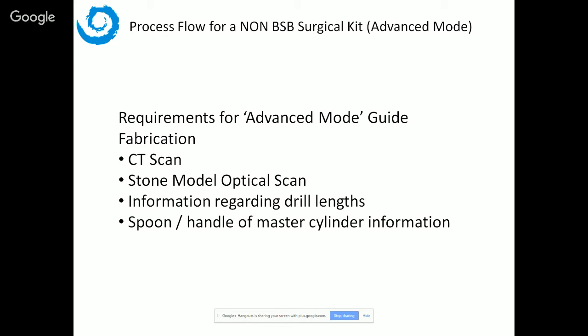Okay, before we jump into this technique, we're going to field a few questions. There's a question that came in before regarding implants in the software. We're happy to add any implant system. If we get the information, then we're able to add it, and we're happy to do so. MegaGen is not currently in the software. A question regarding placing of the implant in more dense bone is something that we're not going to get into now. It's more of a clinical question, and we'd be happy to put you in touch with clinicians that could help answer that question, but I'm not the person to address it.